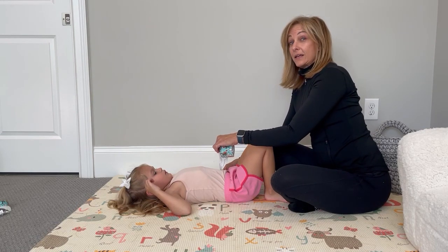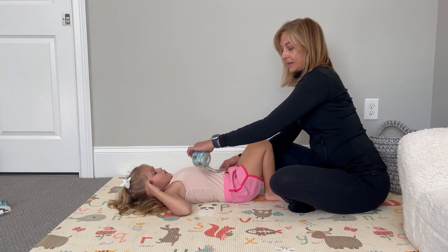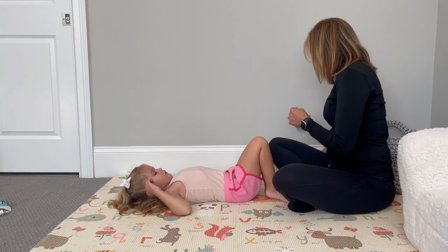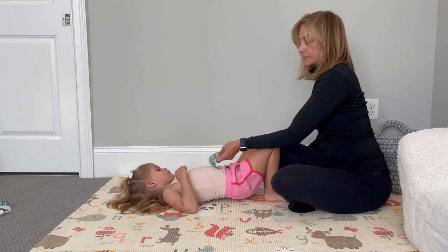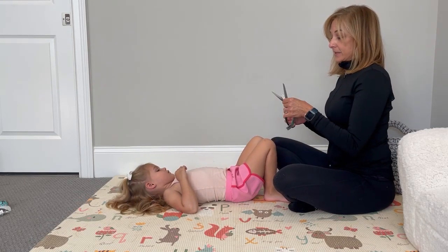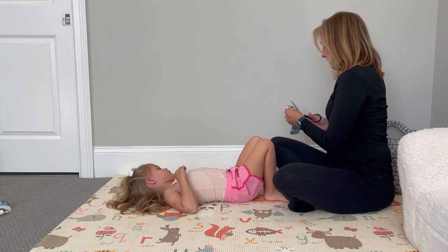You go from the anterior superior iliac spine across to the top of the rib. I'm going to measure, but I'm going to cut it slightly shorter because this application has stretch in it. I'm going to go ahead and use the full strip because she's bigger than a baby — if you had a little baby, you would use half a strip.